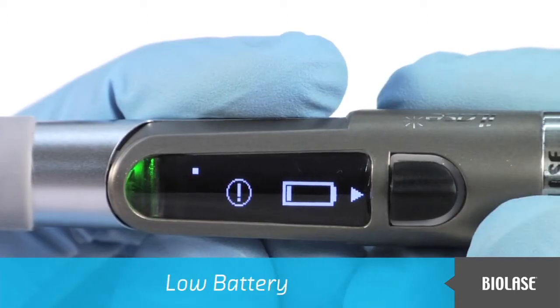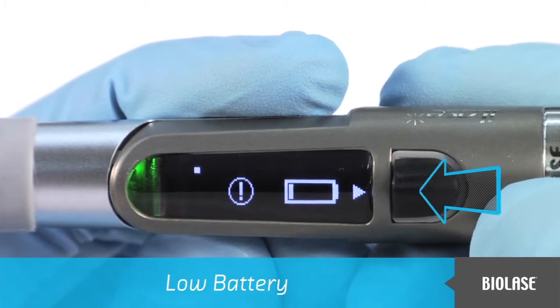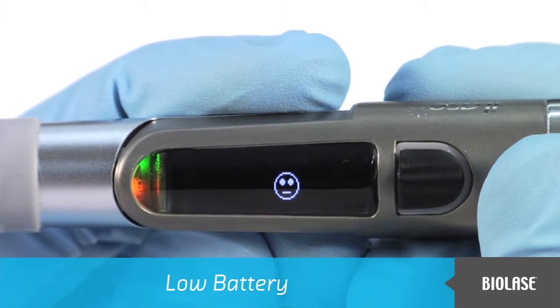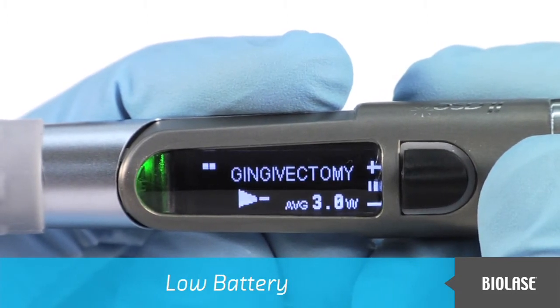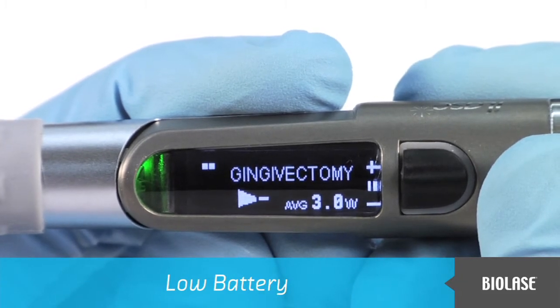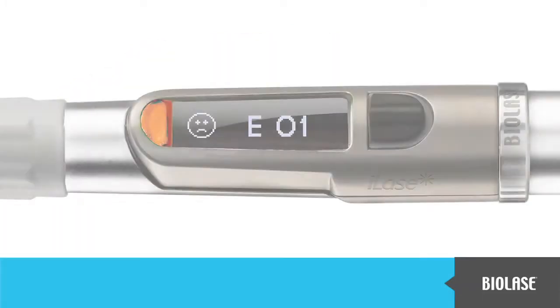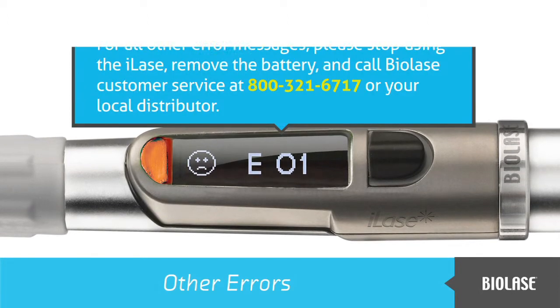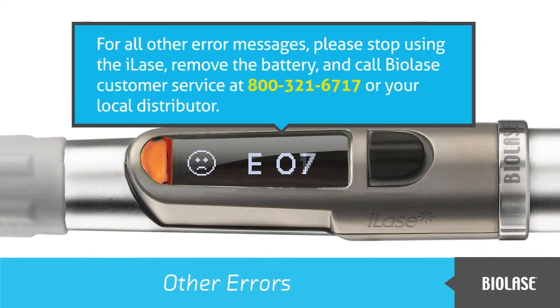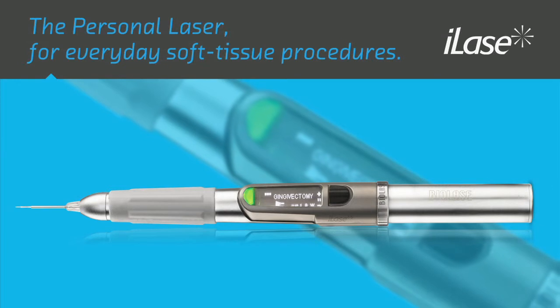When the iLase battery is almost empty, you will see these symbols in the interface display. Pressing in the black navigation button will clear the error and return the iLase back to normal operation. However, it is advisable to replace the battery with a fully charged battery as soon as possible. The battery that's almost empty should also be recharged in the charging station. For all other error messages, please stop using the iLase, remove the battery, and call Biolase customer service or your local distributor. You are now ready to begin using your iLase.